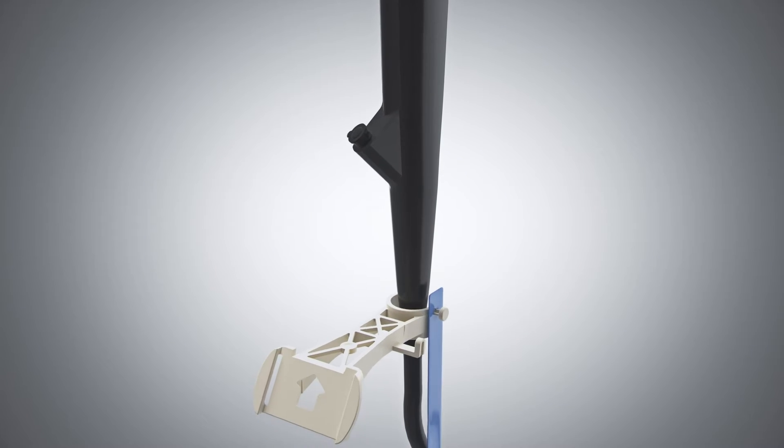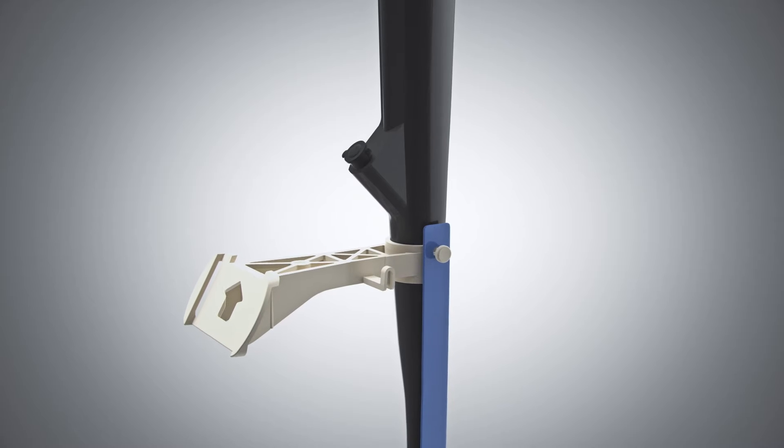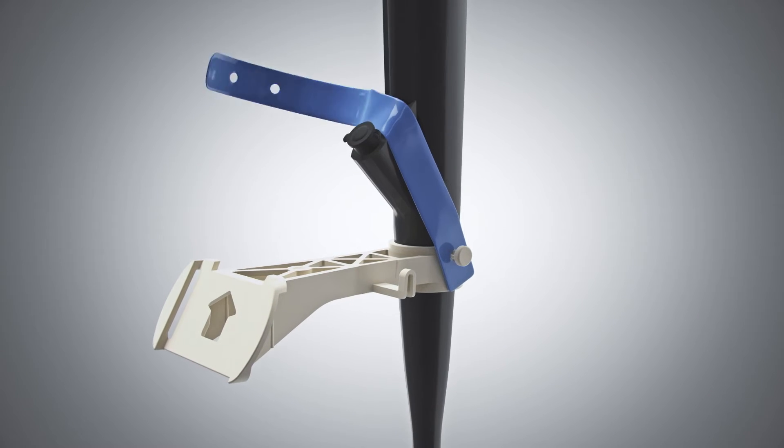Slide the X-TAC bracket onto the scope with the arrow pointing upwards. Wrap the blue strap above the scope channel and secure to the bracket pin.